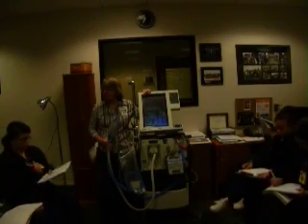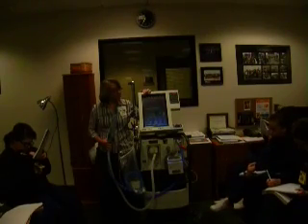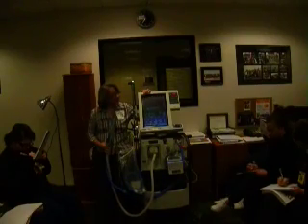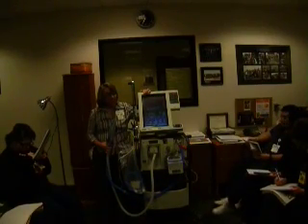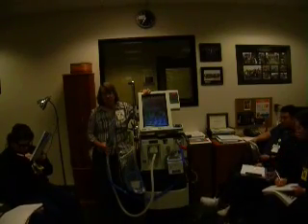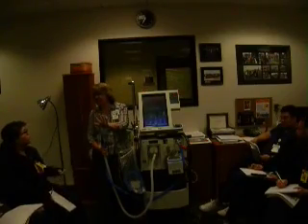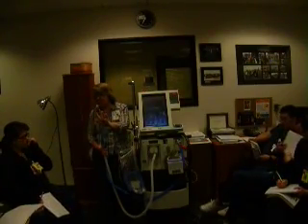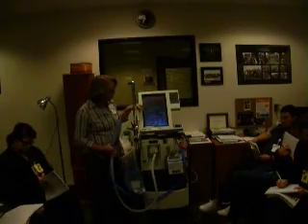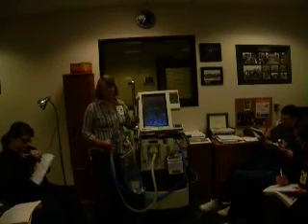Along with the PIP, high PIP is 10 above your average PIP, but no more than 35. That doesn't mean it goes on 35 for everybody. If your PIP is 15, your high pressure would be where? 25. If it's 30, where is your high pressure? 35. No more than 35. There's exceptions to every scenario, you guys. Remember, this is the 95% rule. We'll talk about the exceptions later. All right. So frequency, high frequency, needs to be 10 above what your patient's averaging.